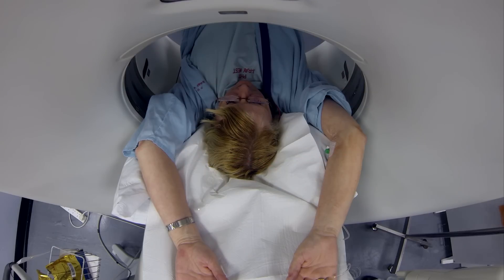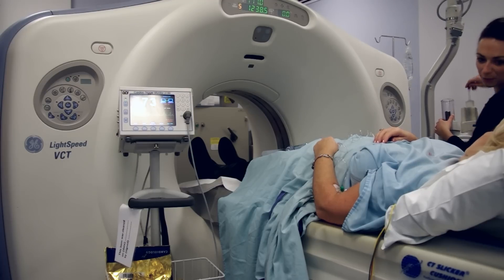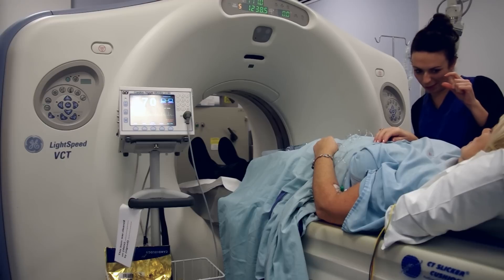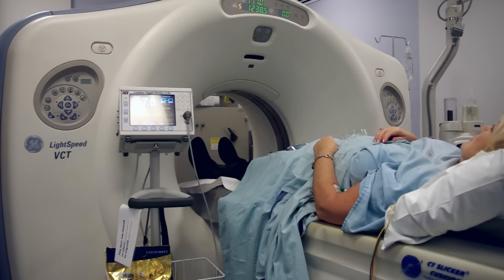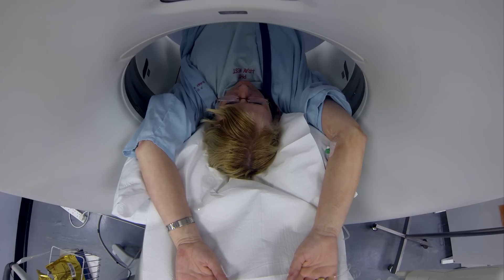You'll be asked to breathe in and hold your breath each time, and it's important that you try and take roughly the same size breath on each occasion. The radiographer will warn you when the x-ray dye is about to start. The dye might give you a strange taste in your mouth or make you feel warm all over. It might get so warm down below you feel like you've wet yourself — you won't have done, but it's a strange feeling. These things wear off quickly within a few seconds; they're normal, so try to ignore them and concentrate on holding your breath.